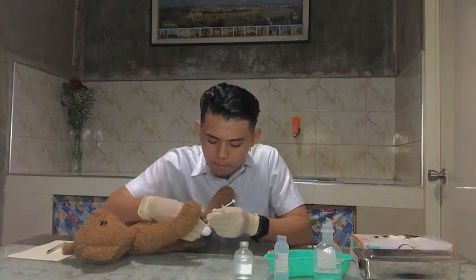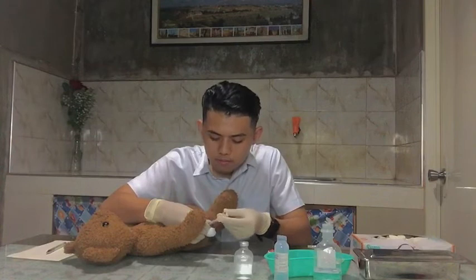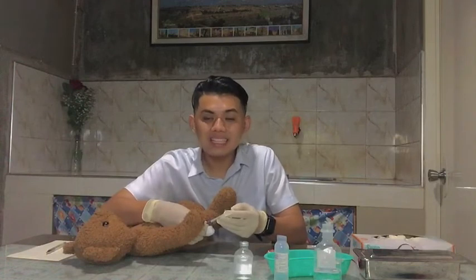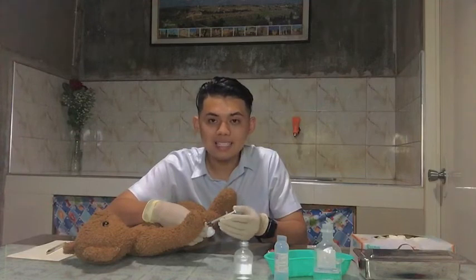And then hold the barrel of the syringe steady with your non-dominant hand and aspirate by pulling back with the plunger using your dominant hand. So, aspirate for 5 to 10 seconds. If blood appears in the syringe, withdraw the needle, discard the syringe, and prepare a new injection. But if blood does not appear, inject the medication steadily and slowly, approximately 10 seconds per ml.